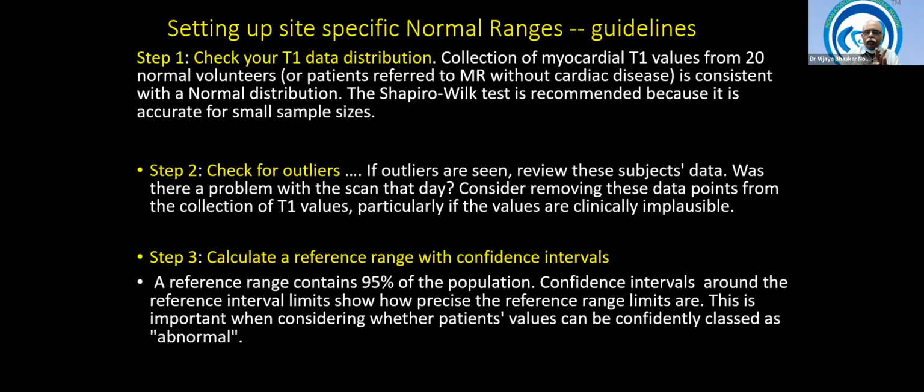All of them the same. Compare with that particular external reference range. A lot are available on the internet. Compare. Then decide, okay, my 940 to 960 or 940 to 980 is the normal range. It might be. In these 20 healthy subjects, if all 20 are right, start using your normal range.